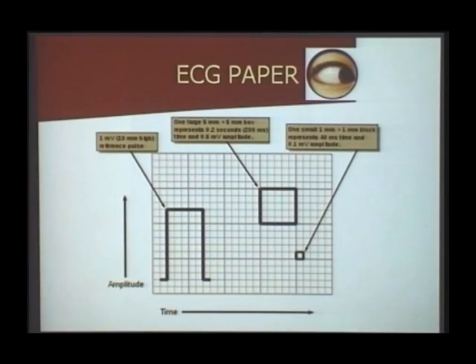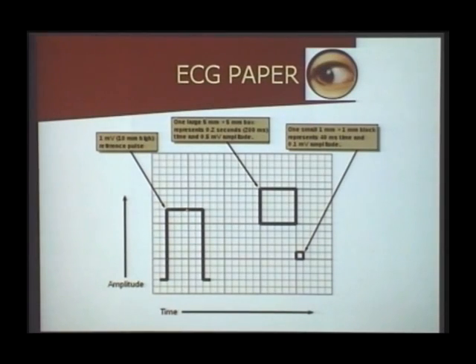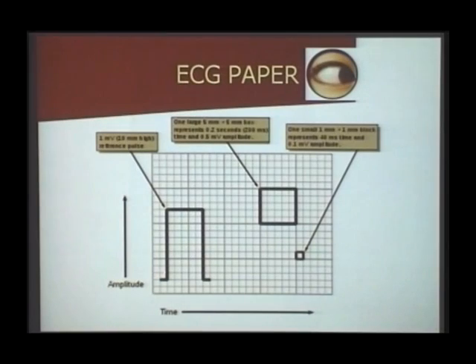So, in any ECG, before you interpret an ECG, you have to look at this vertical bar which is being recorded. In many ECG machines, it may be recorded before each one of these leads, or they can give it in the bottom of the ECG paper or in the side of the ECG paper and say in which standardization they are recording and which speed they are recording. Without making sure of this standardization and speed, you are not supposed to interpret an ECG. Very, very important. You have to make sure the ECG is recorded in 1 millivolt standardization.